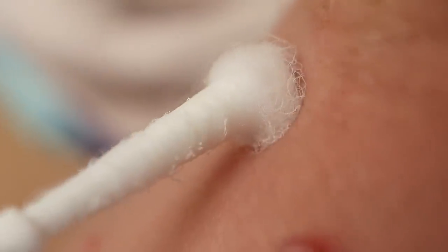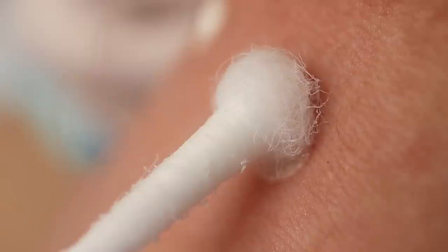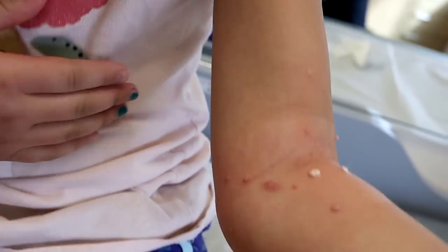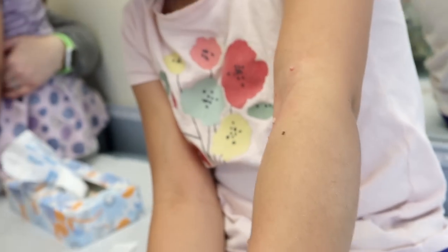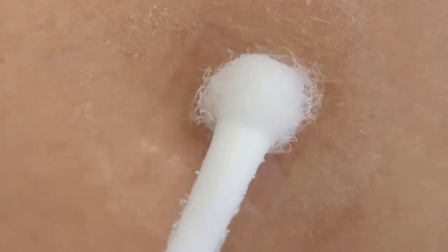Can you still feel your hand? Yeah. There's a seal next door. Did we get the ones up above? Yeah, we did. Good job. And then we've got one there, and then behind the leg. You want to stand up maybe for us to get those? That one's worse? Maybe the back of the leg is just more sensitive — more nerve endings. I know if it's on your fingertips or toes, that's really rough.